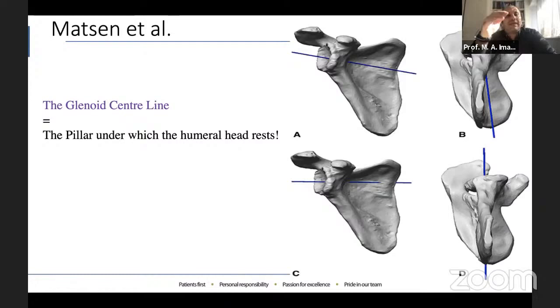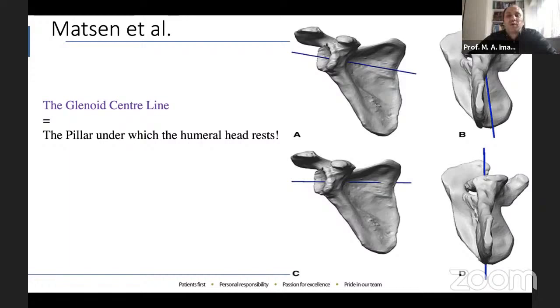Ideally, when doing a reverse shoulder replacement, you should place the glenoid component along the glenoid center line. However, in cases of glenoid bone loss, component placement in this plane might not be possible. In cases of severe or eccentric glenoid wear, a stable base plate fixation can only be achieved by placing the component along the alternate glenoid center line, as seen in figures C and D.